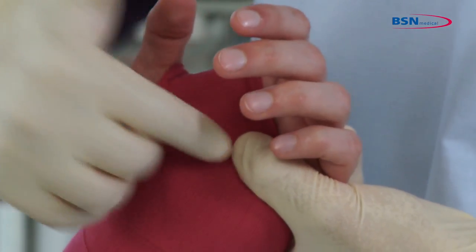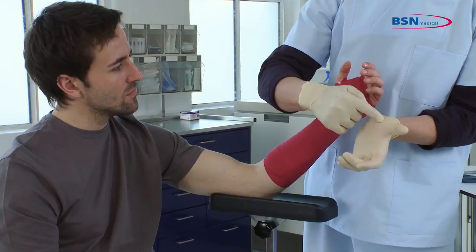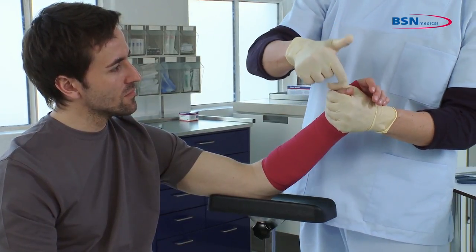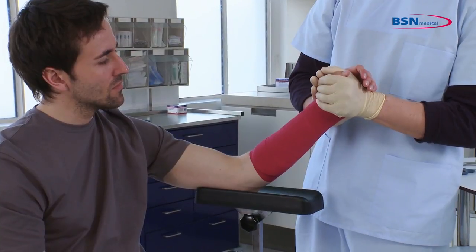Mold the splint inside the palm with your thumb or palm of hand. Use your thumb to hold the patient's thumb and place the patient's hand inside both of your hands until the splint is in a rigid position. Mold as prescribed by the physician.